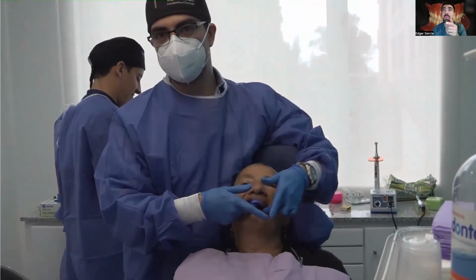The bite rim is not cut. You don't cut it off. At this point, this is the first step in the second appointment: do the border molding. In other words, you have the tray with the wax. The wax is at the average ranges for the upper and mandibular bite rim wax, but you haven't created any notches on this wax. All you're doing right now is using the actual custom tray for your border molding, and then your final impression. Is that correct?